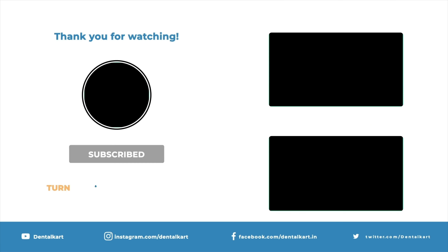Maxillary root forceps, also known as bayonet forceps, have straight handles and narrow sharp beaks designed to grip and apply pressure to the root during extractions. Additionally, their flat surface offers stability for better leverage.